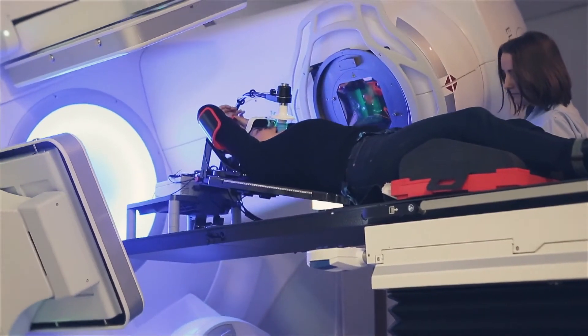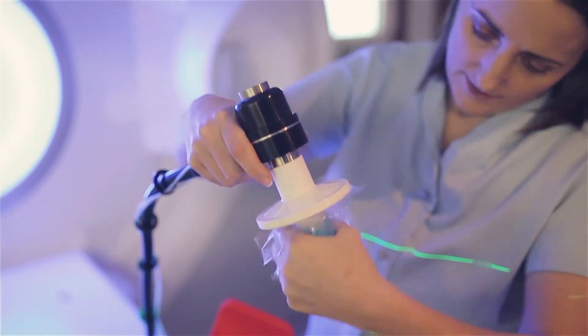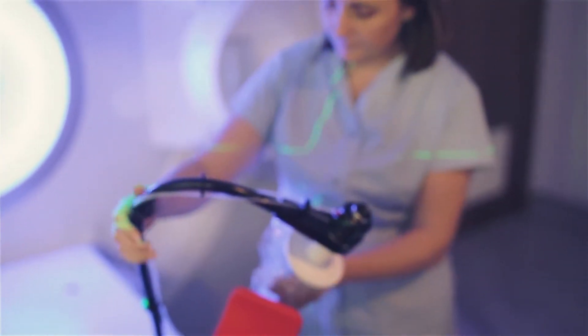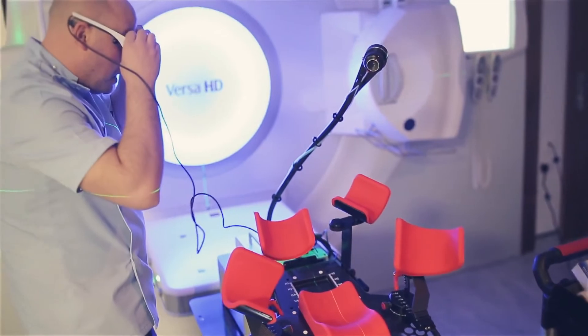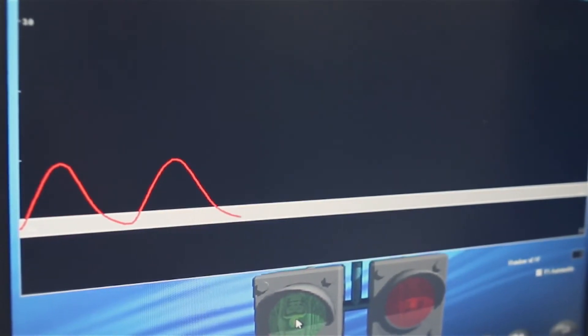To administer the deep inspiration breath hold technique we ask the patient to wear a mouthpiece which is attached to a spirometer. It doesn't look dissimilar to a snorkel mouthpiece and they simply just breathe in and out. They also wear a set of visual display goggles which show a screen with a very simple traffic light system indicating when they need to breathe and hold their breath and then breathe away normally.